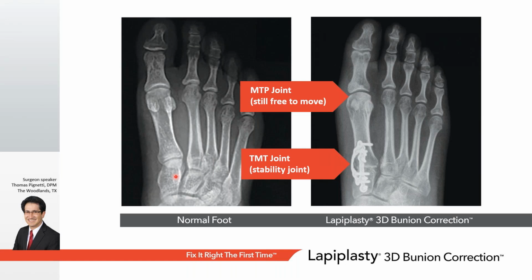Okay. This person asks, do you break the bone to move it during the procedure? Yeah, this comes to one of my little pet peeves, breaking the bone. I kind of get this picture of using a sledgehammer against it. When we move the bone, what we do is we release the tissues around that unstable joint, and we apply that instrument.